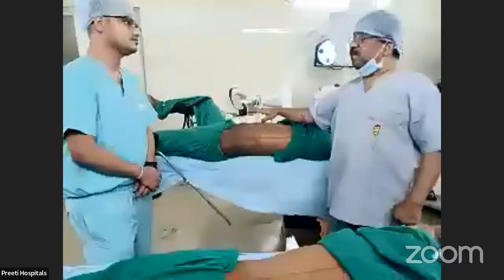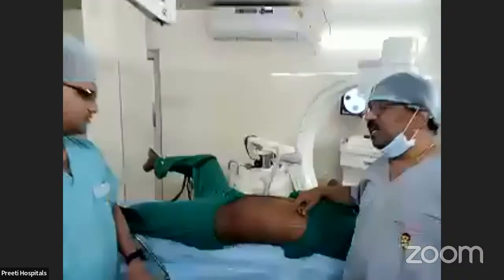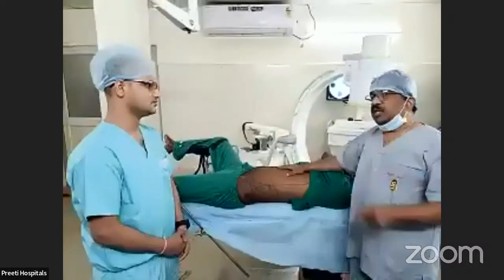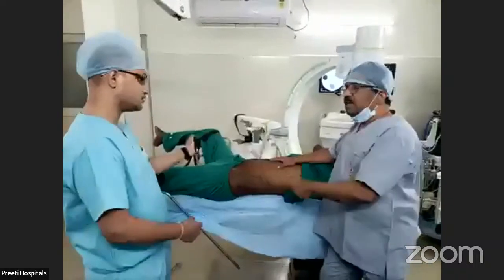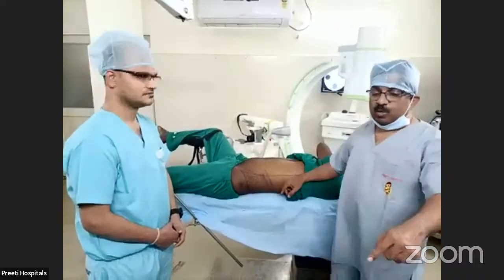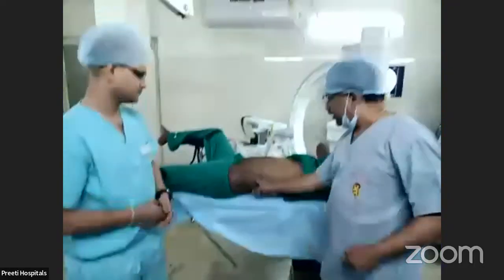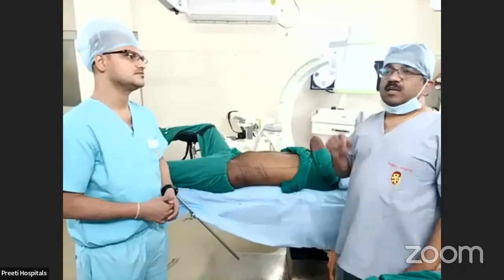One question: if a ureteric stone is there, from supine or prone, where can you reach the middle calyx easily? Supine PCNL is better, because from the supine middle calyx the upper ureter is easily approachable, infracostal at the same time. Sometimes you can reach up to the mid-ureter also. To reach the mid-ureter in prone, you have to puncture the superior calyx supracostally, then only you can go down, whereas here from the middle calyx you can reach the ureter easily. That is the advantage.